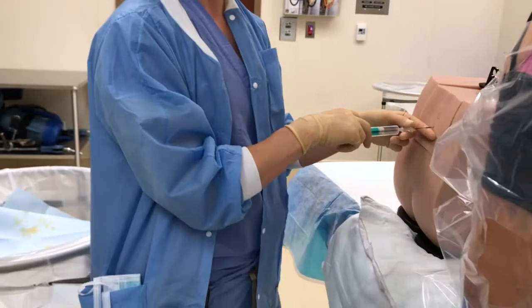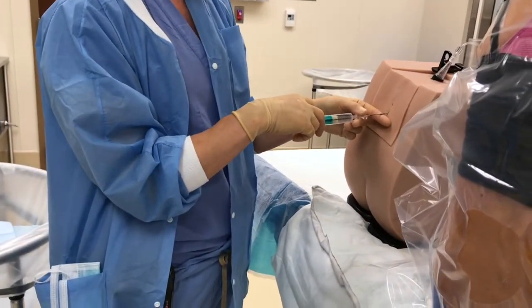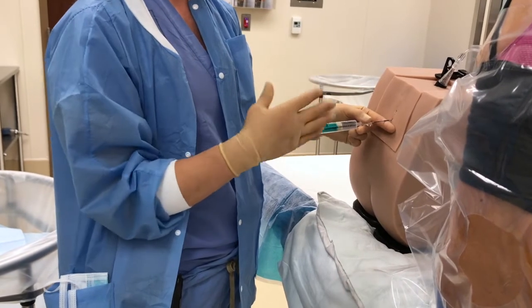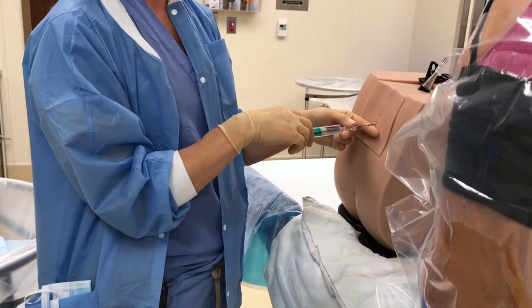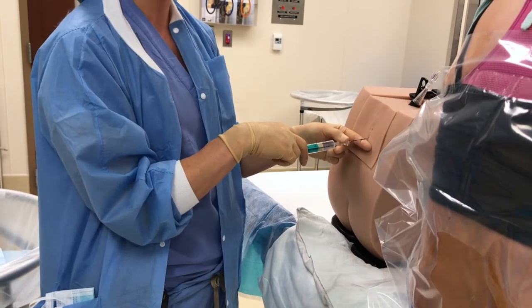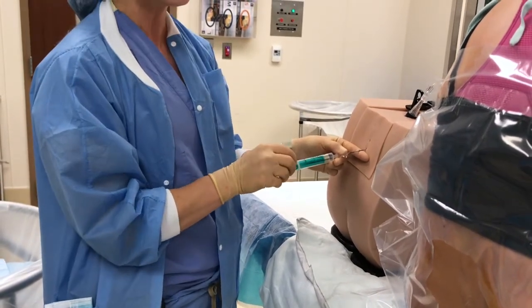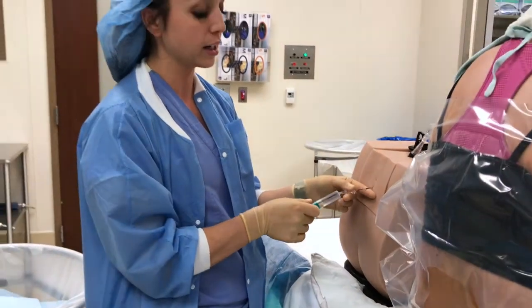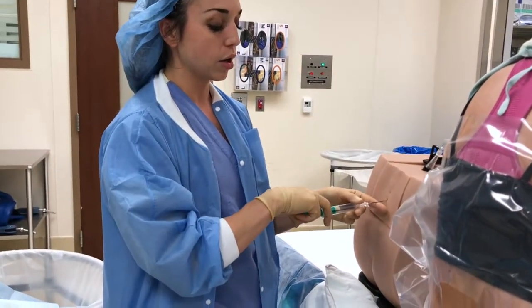This is very difficult to teach. It's a very unique tactile sensation that you'll just get better and better at delineating over time. So it's going to be very difficult for me to describe it, but basically it should not easily give. If it's easily giving, you may be in sub-Q or off midline. It should feel like a nice fluid resistance.